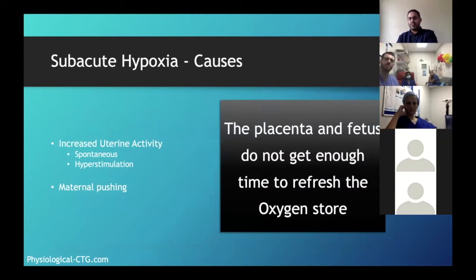I've told you all about the baby that I delivered and found that it actually had the cord in its hand, literally just squeezing it. It goes into a spasm, squeezes it, and then faints, so lets it go. The moment it wakes up, it squeezes it again. Crazy baby. But that was the only interpretation of the trace. And when I delivered, it had two loops wrapped around its hand. So the idea is you have little time for the baby to refresh.